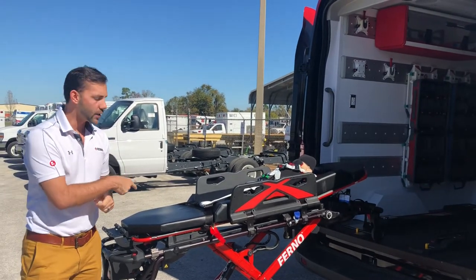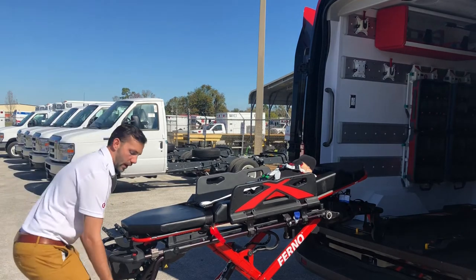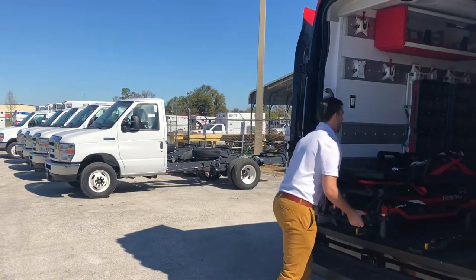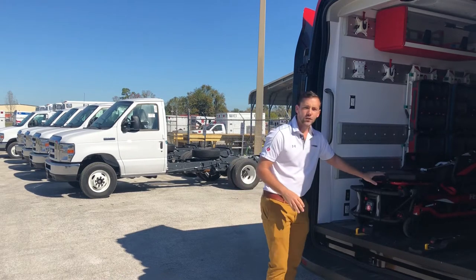Now we're going to load our Power X1 into our Pro F1 Universal Fastener. I'm going to lift from the bottom, press my minus button, and lock in. Now this stretcher is locked.